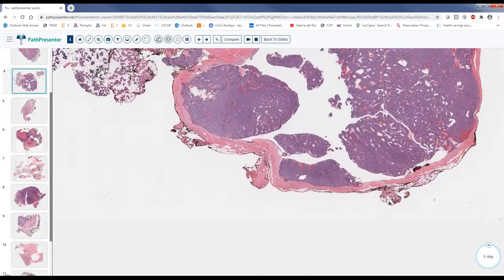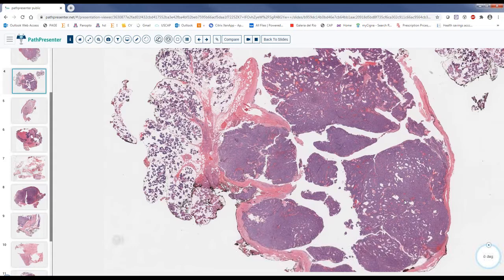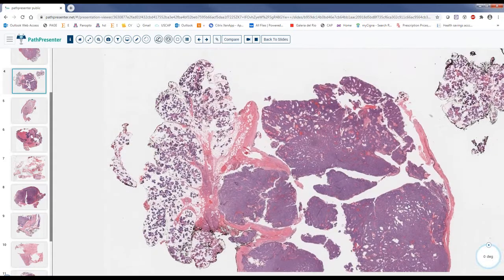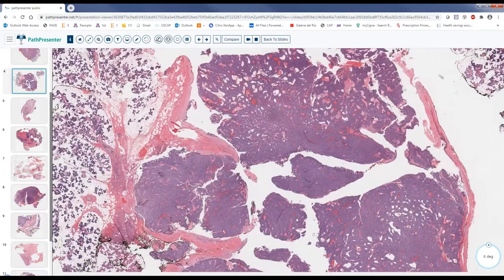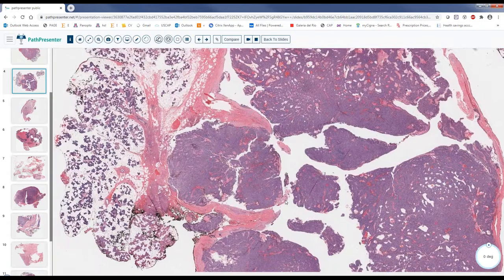The caveat here is that the area of the fine aspiration may give you pseudo invasion, capsular pseudo invasion. So you have to really be careful that you are dealing with capsular invasion away from that area. You see fibrosis, hemosiderin-laden macrophages, capsular disruption. Does it mean by default you are dealing with capsular invasion? No, those are changes related to the fine aspiration.